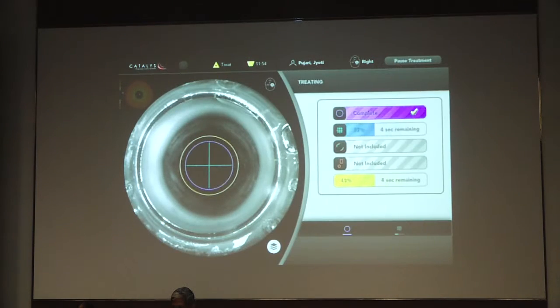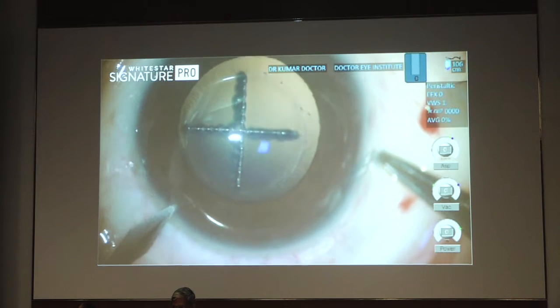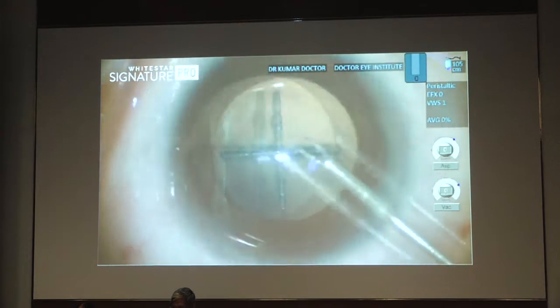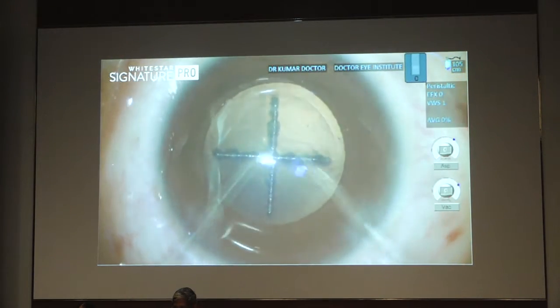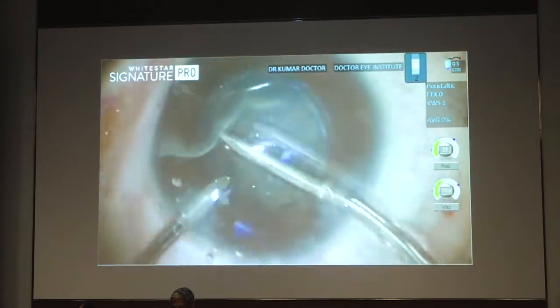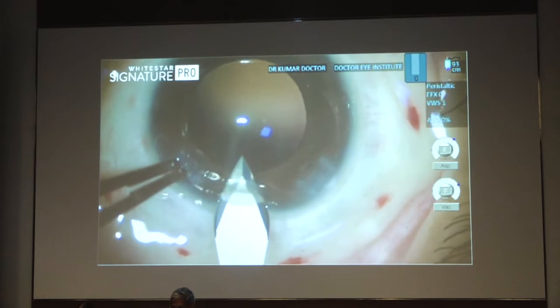Patient taken up for femto, and a 4-quadrant division of the lens performed. A 0.75 millimeter sideport incision made and a gentle release of the aqueous, replaced by an OVD. Using a microrhexis forceps, the CCC was grasped out. Bimanual IA used for aspirating the lens material. Globe not allowed to collapse because of the use of the OVD. Main incision of 3.4 millimeter made.